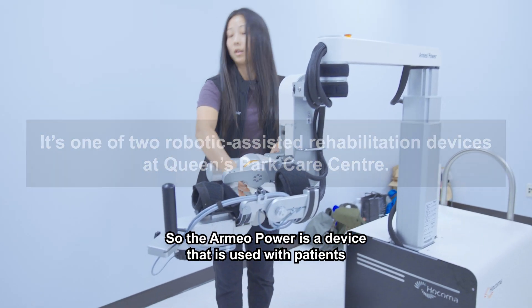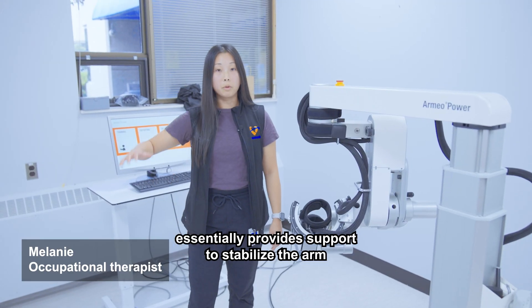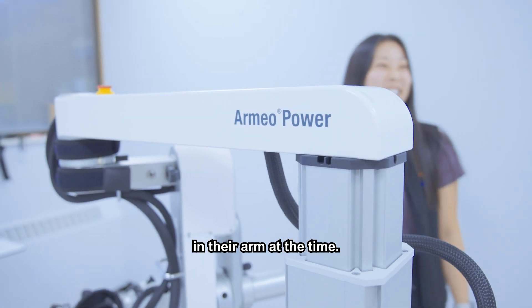The Armeo Power is a device that is used with patients who have lost functioning in their arm or hand. It essentially provides support to stabilize the arm, as well as helps it to move, even if someone has not a lot of movement in their arm at the time.